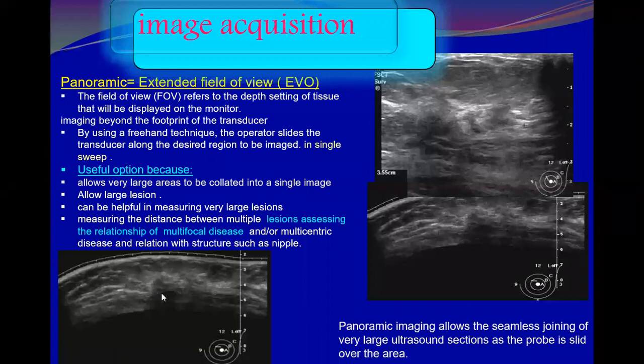And you can also evaluate the lesions in relation to other structures, like in relation to the nipple and so forth.